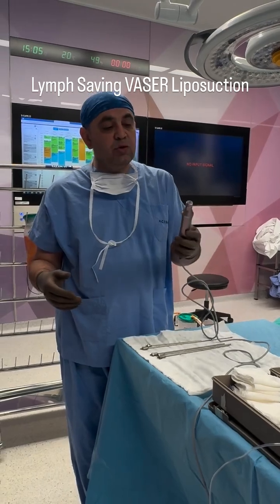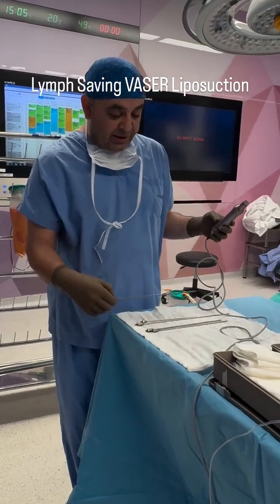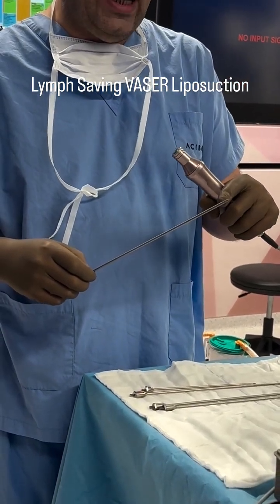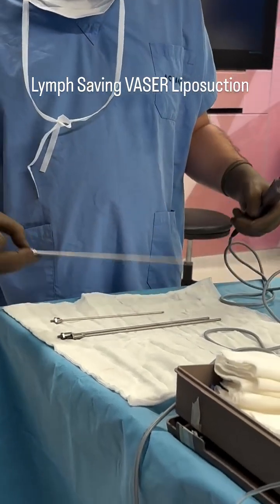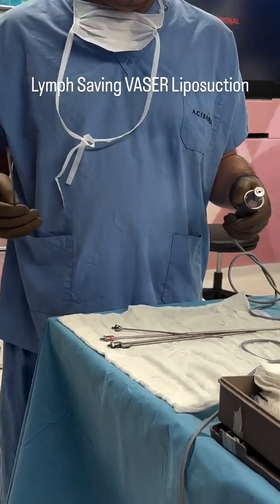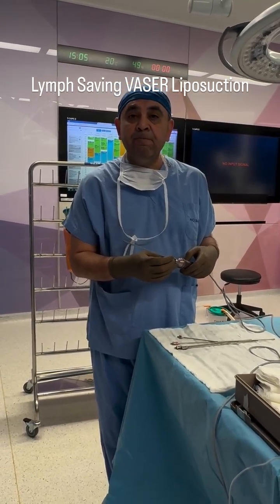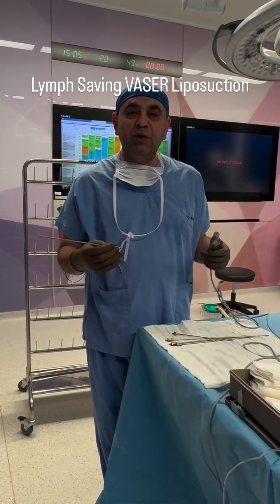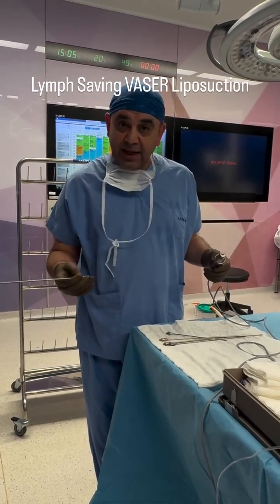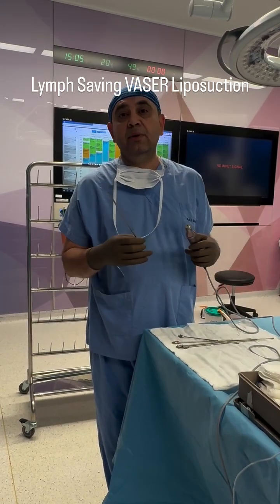Now let me give you some technical details about VASER. This is the handpiece and these are the different probes. The probes have a different amount of hollows on the tip. We also have long or thin probes according to the area. This probe delivers a specific wavelength of ultrasound energy to the tissues that selectively destructs the fat cells, while other tissues like capillaries, lymphatics, or nerves are not harmed.